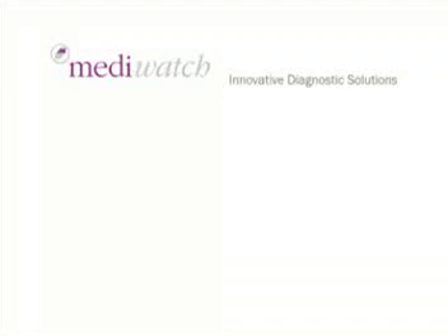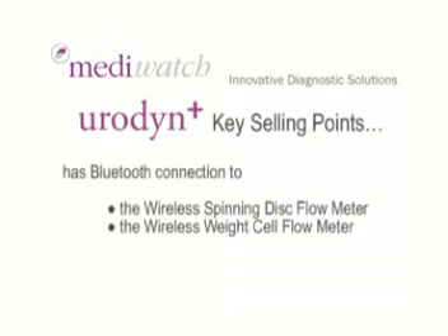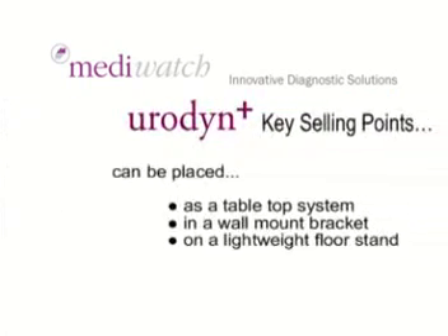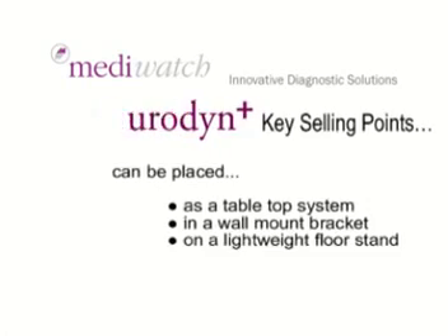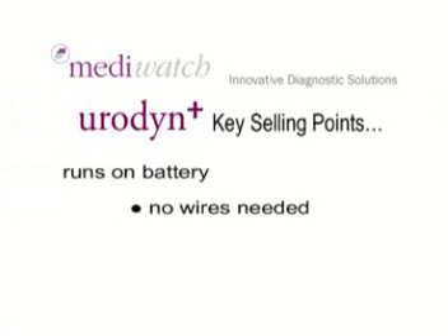A reminder of those key selling points: Urodyne Plus has Bluetooth connection to the wireless spinning disc flow meter and the wireless weight cell flow meter. Urodyne Plus can be placed as a tabletop system, in a wall mount, or on a lightweight floor stand. Urodyne Plus runs on battery — no wires needed.